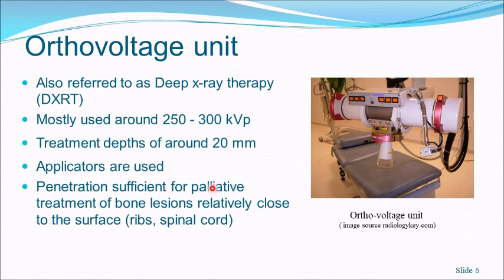Penetration is sufficient for palliative treatment of bone lesions relatively close to the surface, that is to treat ribs, spinal cord, etc.